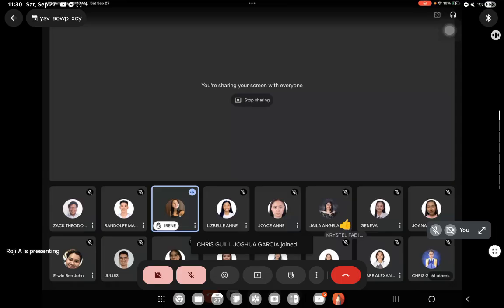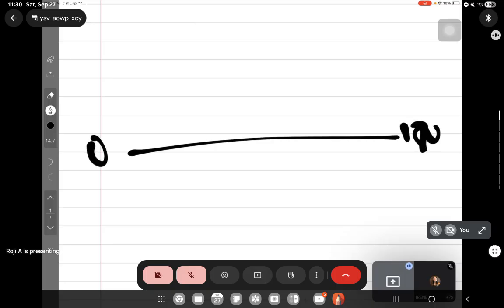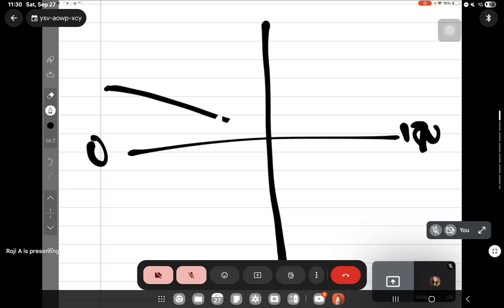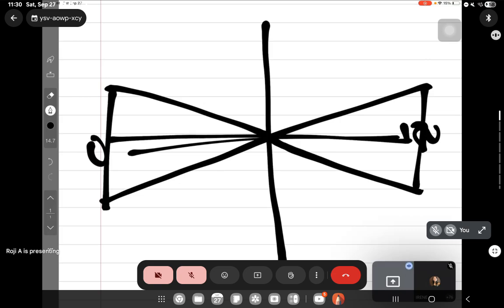Let's do it. First question of all the questions. You said you want to know the with the rule and against the rule, correct? If I am to understand, this is 0, this is 180, correct? So if I see that this is a range, this one is my against the rule.